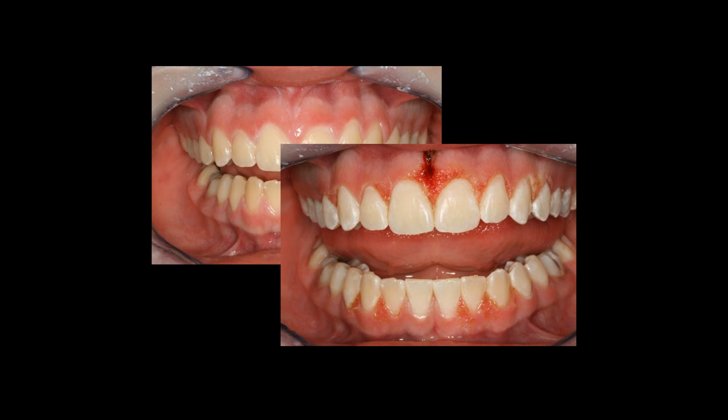The other thing to look at is when you look at these cases and you're going to start changing the gingival contour, pay attention to the frenum position as well, because sometimes if you raise that contour a millimeter or two, you get awfully close to where that frenum pull is, and in those cases you want to make sure that you treatment plan a frenectomy to move that frenum out of the way so it doesn't pull the tissue up. If you don't treatment plan it from the get-go, you'll end up doing a lot of free frenectomies, which nobody wants to do. So just take a look at the pull and where your end result's going to be with your gingival recontouring. So here's a video showing a post-orthodontic case.